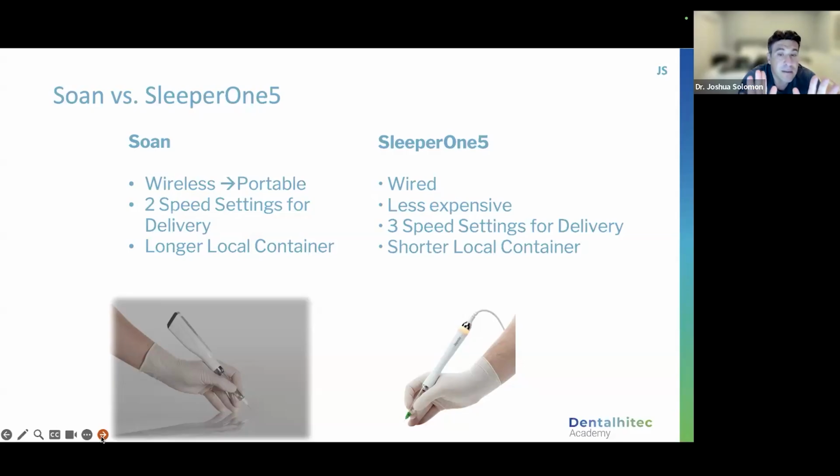I really encourage all of you, and Ann and I don't get any money from you buying units. We don't get like a 5% kickback. When you get to the point where this is the type of local anesthesia you deliver, you need to buy multiple units. Yes, they're portable, but the last thing I want you to do is have one of your assistants drop these, right? Because they do have a warranty, but not if you drop it from 5 feet up. And yes, they're portable, but you don't want to be moving this back and forth in the office.